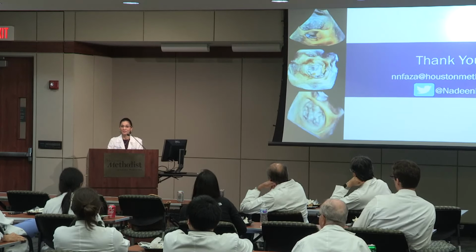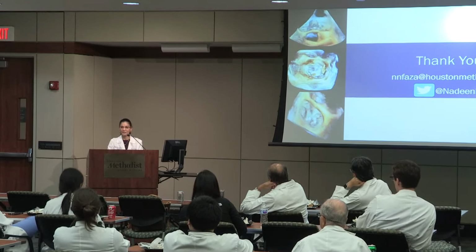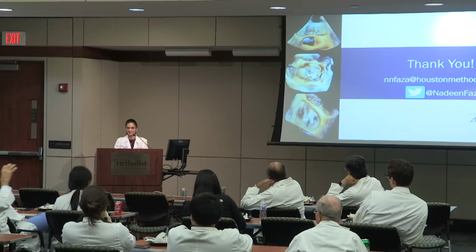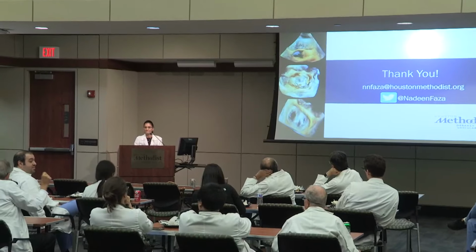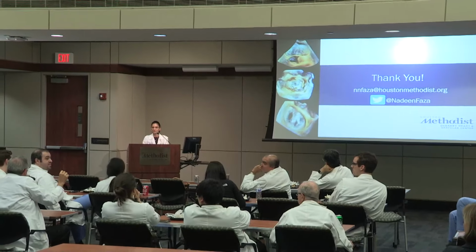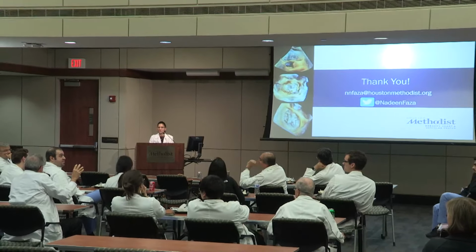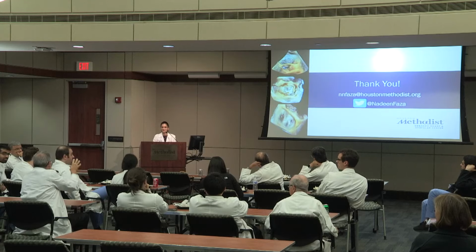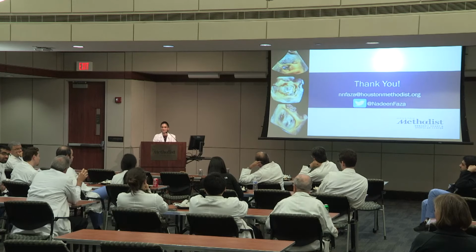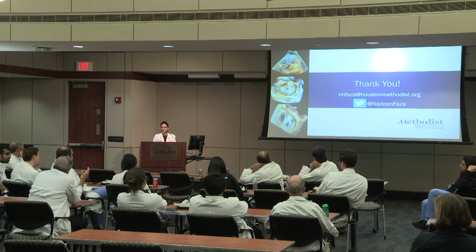Zoom 3D. So you're still using the 3D zoom, the biplane creation of the two areas of interest and switching to, okay. So the problem with that one is that any little movement of the probe, you're out of place. So how do you stay in place? Because that's not so easy. I mean, in real time, you can correct very quickly, but once you do that, any little movement, you are out. That is very true.